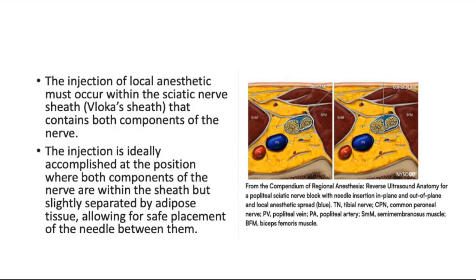All those papers used high resolution ultrasound to identify the nerve at either the subgluteal or the transgluteal level. But most of them talk about the subgluteal level, because that's where the nerve is still in the same fascia plane as the sciatic nerve and is more superficial, before it starts to deviate away from the course of the sciatic nerve. By the mid-thigh level the sciatic nerve is a bit deep, but the PFCN has diverged and become a superficial nerve.